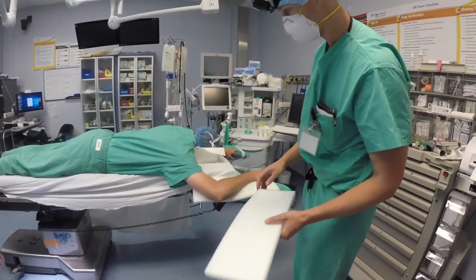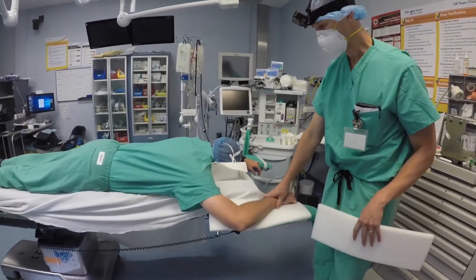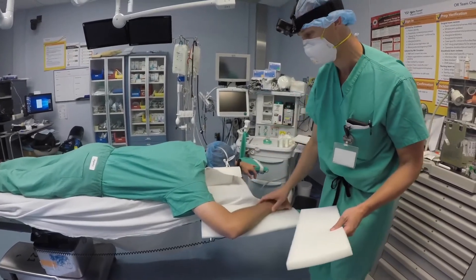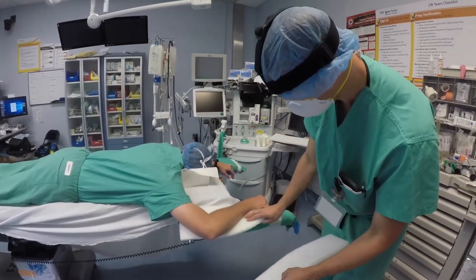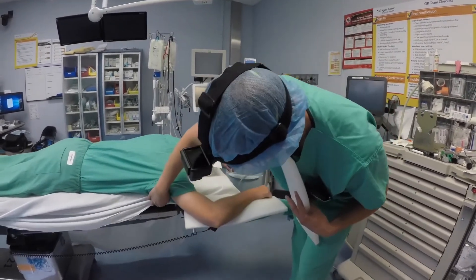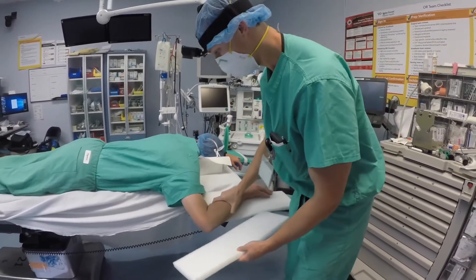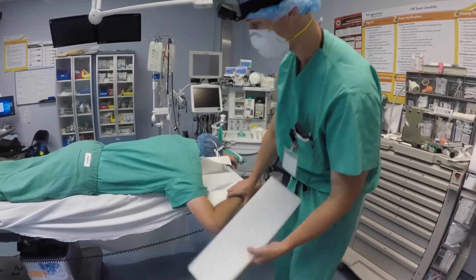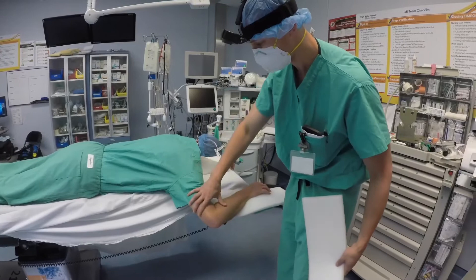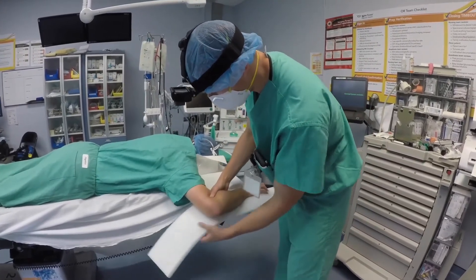The other thing to notice is how the arms are positioned. In this position, he's a little too extended, which increases the risk for both ulnar and axillary nerve palsy post-operatively, so we want to minimize that. He has foam on the armrest attached to the head of the bed to give more room for the C-arm to move up and down. We're going to bring his arm into a more neutral position — what we call Superman — with 90 degrees at the shoulder and 90 degrees at the elbow. We'll also provide additional padding over the elbow to pad the ulnar nerve.